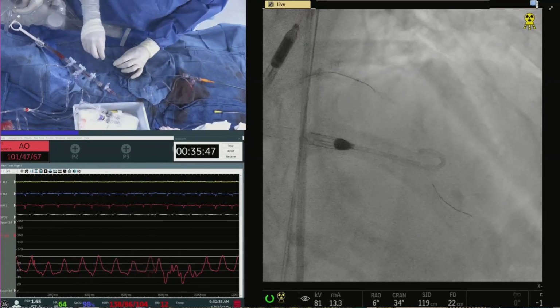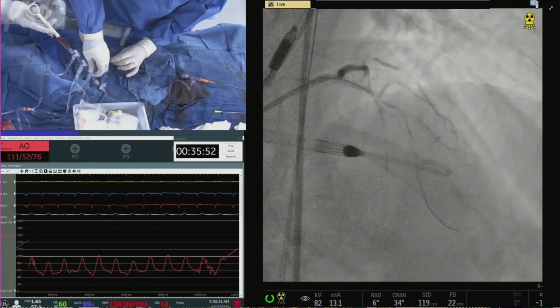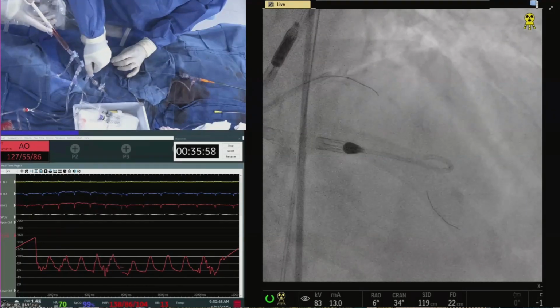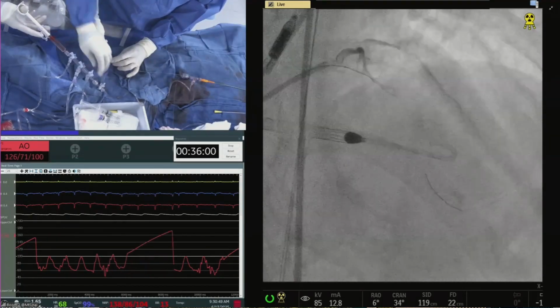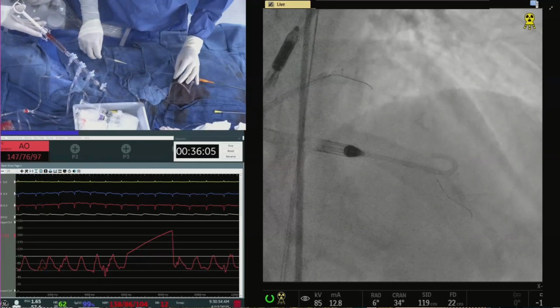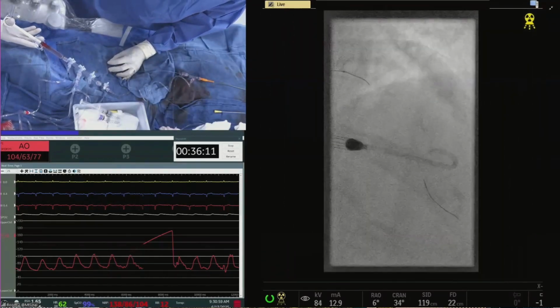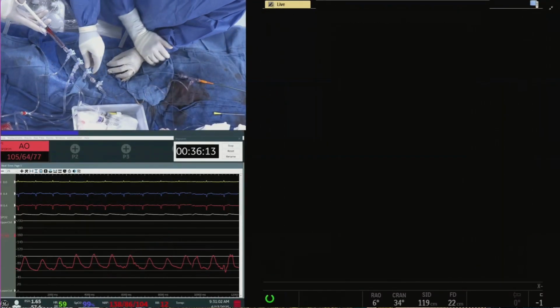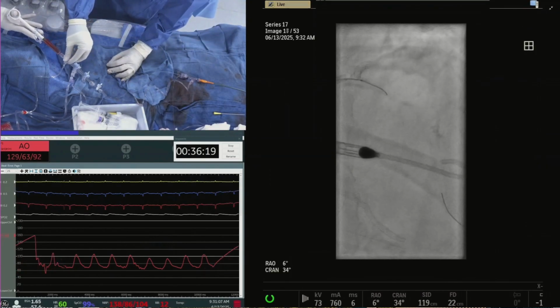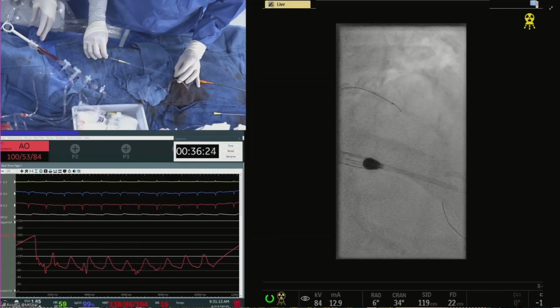So right here, right? There's the same Fielder wire. There you go. I think you're going to get it. Maybe it starts a little more proximal, more proximal than we think it is. Okay, look at the way it is taking off. Actually, it's more distal, and it's got a retrograde entry. Yeah, this might be a case.